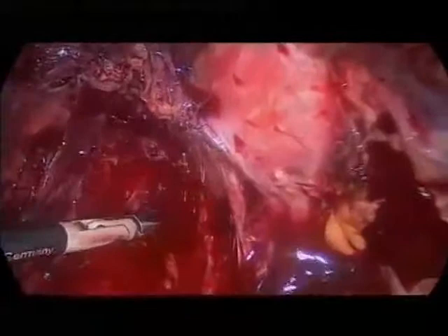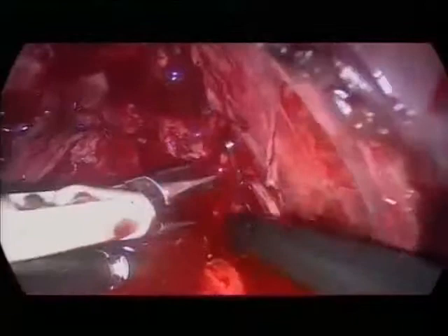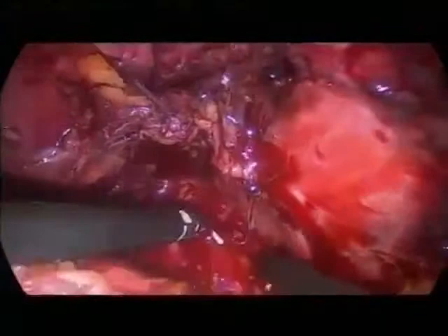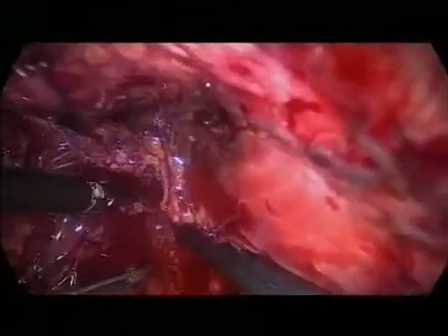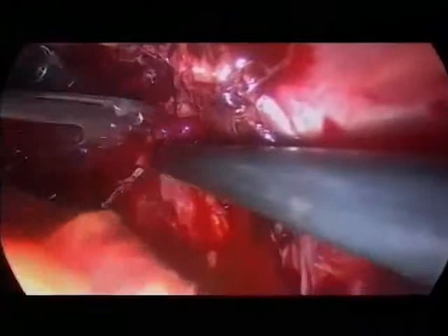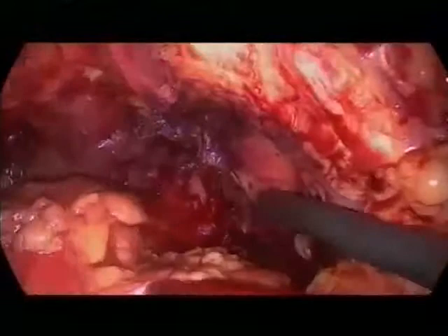Richard, I have seen you doing this technique by conventional laparoscopy. You see, by conventional approach, Claude, it's a little bit more difficult. You see the seminal vesicle here, and I try to find the limit here. We have to take a lot of caution to be very close to the prostate. For example, here we can protect the tissue here. You see, we can put a clip at this point.